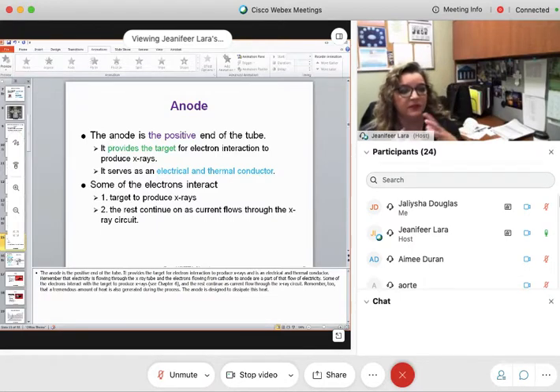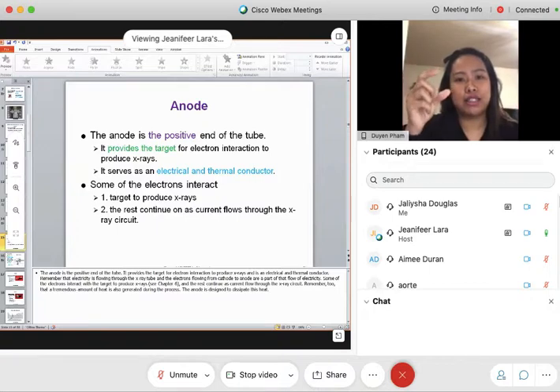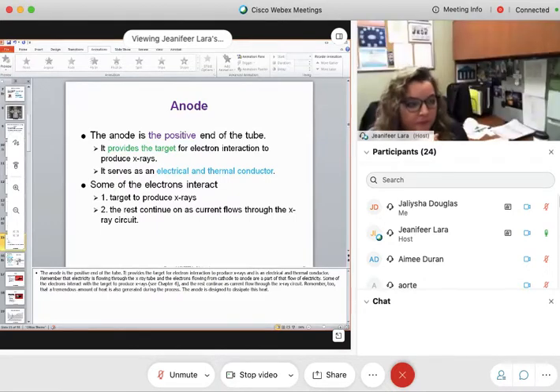What does the stator do again? What's the purpose of the stators? Okay, the stator uses the electromagnet, and the stator is outside the envelope, and it's going to help the rotor, and the iron in front of the rotor is not going to stick together. It's going to stay separate, but it's going to have the irons move. It's going to have the rotor spin. Yeah. What is the rotor spinning, Amy? That is so important to us.